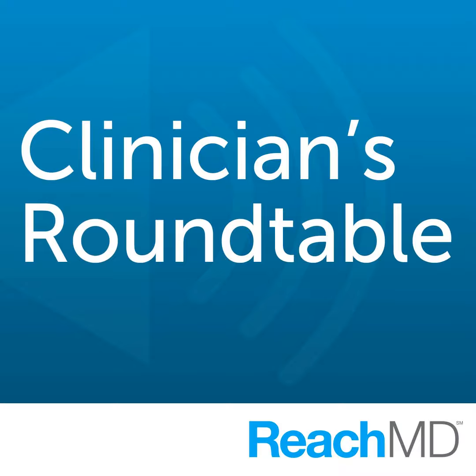There was a couple of papers a number of years ago. I think they were entitled The Cult of the Swan-Ganz Catheter. Do you think that there still is a role for right heart catheterization in our CCUs, in our ICUs, in helping to manage patients? That's a great question. And I think there's 4 or 5 studies out now, all relatively large and well done, patients in ICUs that showed no benefit to right heart catheterization in terms of survival. And I think that has led a lot of people to question whether right heart catheterization is actually beneficial in those patients. Now, I will say a couple caveats.